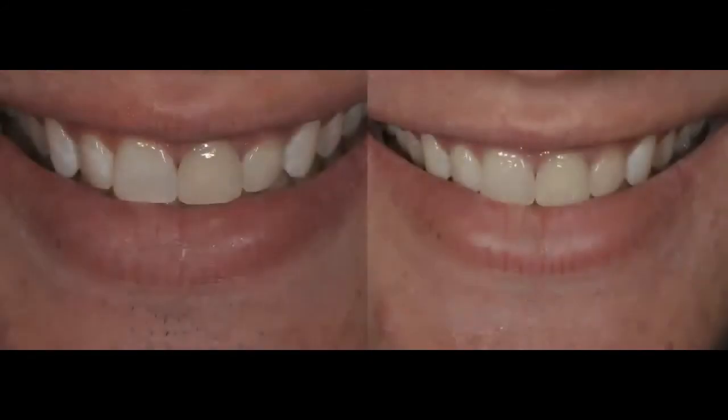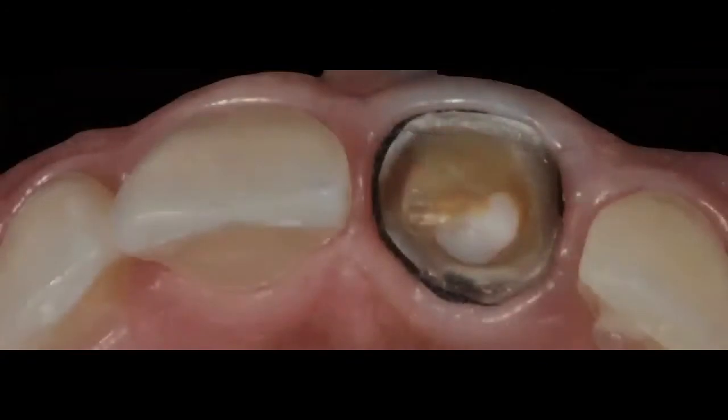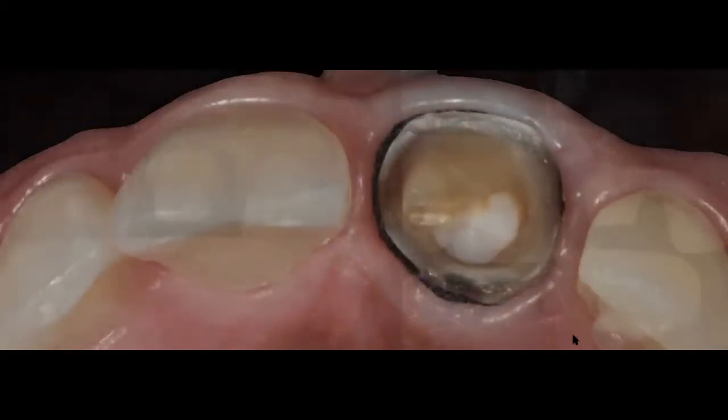So this is my temporary. I went ahead and removed the previous restoration. We did some modifications of some of the neighboring teeth with some composite, because the patient was unhappy with the diastema that he had between 8 and 9 as well. So we were going to change that. And now we have our temporary, we have our substrate. We're going to now scan our substrate. We're going to place our cord, and we're going to go ahead and scan that.